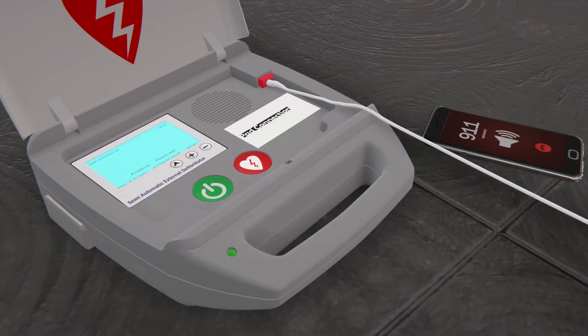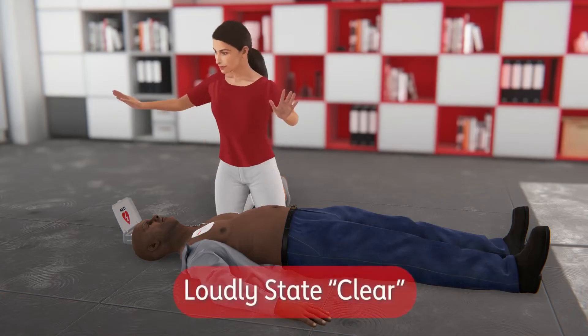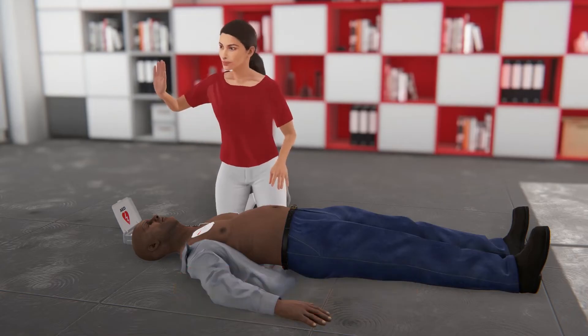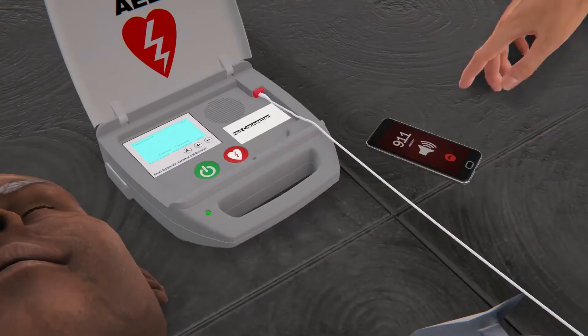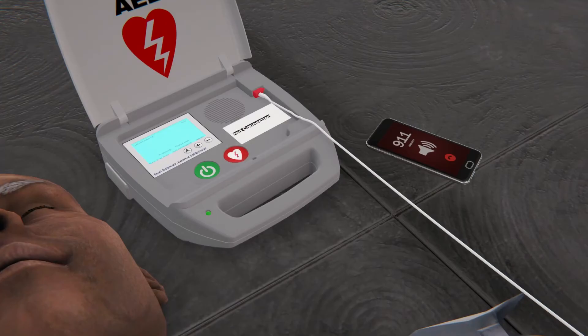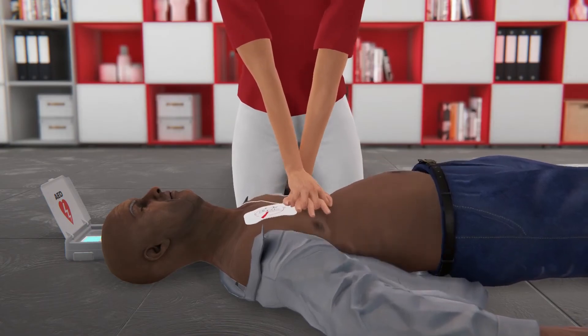If the AED advises a shock — shock advised, charging, stay clear of patient — deliver a shock. Loudly state 'clear' and make sure that no one is touching the person. Push the shock button to deliver the shock. Once the shock is delivered, immediately resume hands-only CPR until help arrives or the AED prompts you to pause.